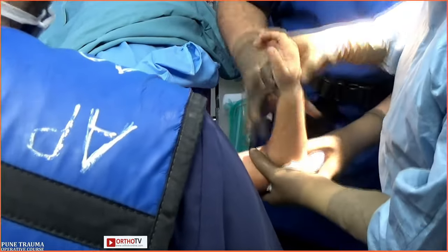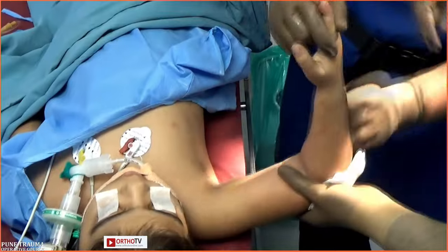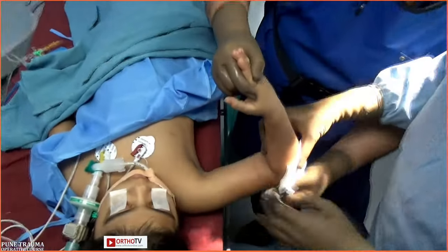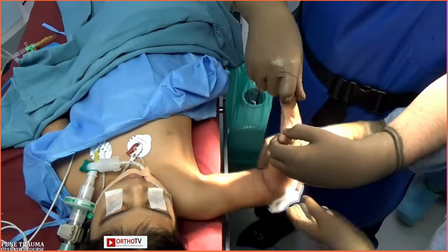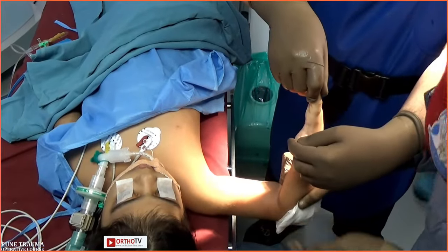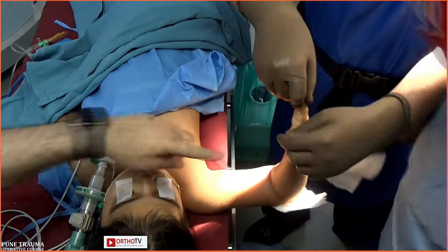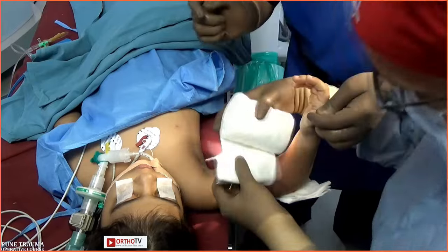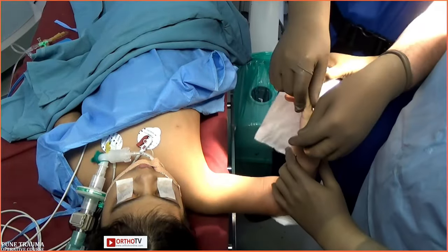Now the whole quest is how to minimize the number of wire attempts. How to get it right the first time. You know, first shot wire. That is all what we want, first shot wire. And there are various ways to do it. And I use two tricks, which I'm going to share with you. The first trick is, on the C-arm, I always draw with a skin marking pen how my wires are going to go in AP and lateral. The second trick is known as wish wire.